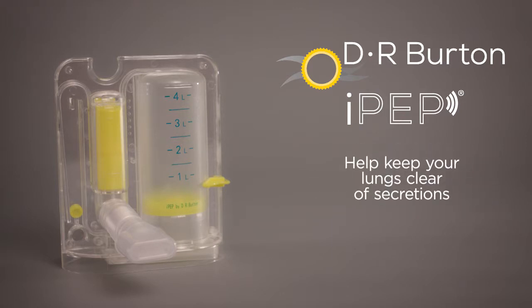The IPEP is also a device used to help lung health after surgery or for lung illness, such as pneumonia, by teaching patients how to take slow, deep breaths.